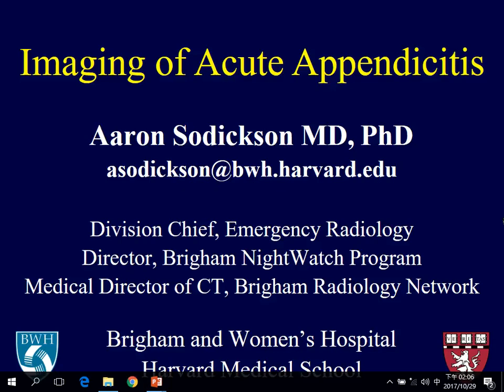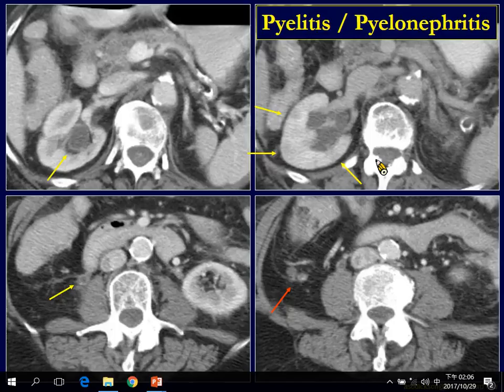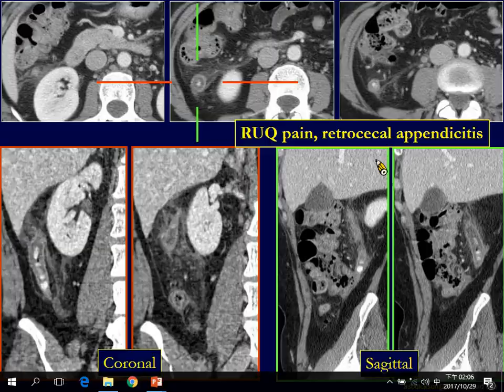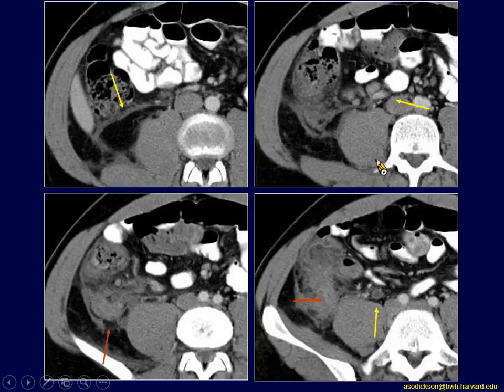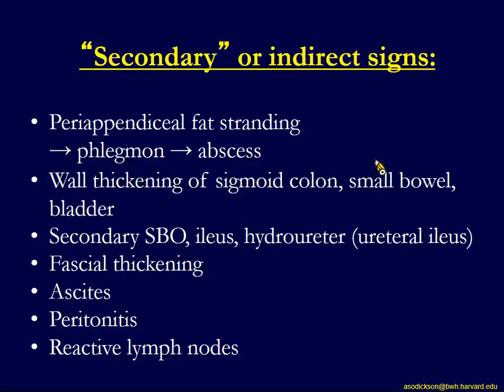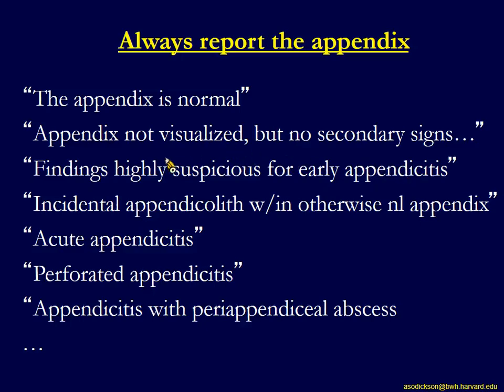Because on one of your slides, you show the wordings you use for your examinations. I think the second or the third is suspicious for early appendicitis. Yes. That is my concern, because nowadays you see some recurrent appendicitis because we use antibiotics. And I don't know whether we can still use this diagnosis for most of our patients. Suspicious, I think this. The third one, this one here, I said highly suspicious. Here, to me, this means almost diagnostic of.